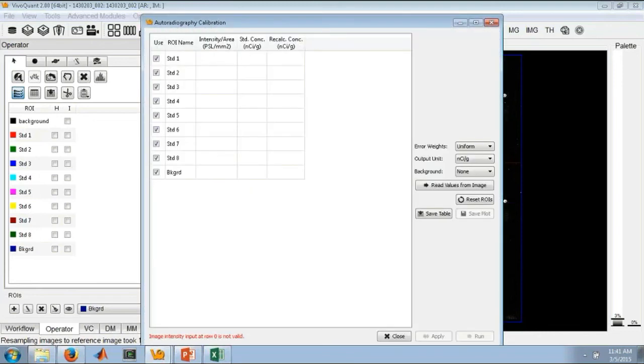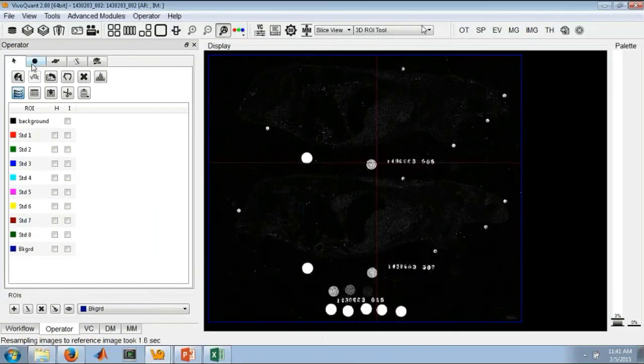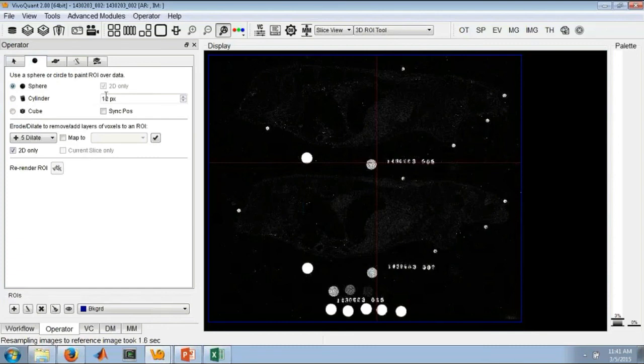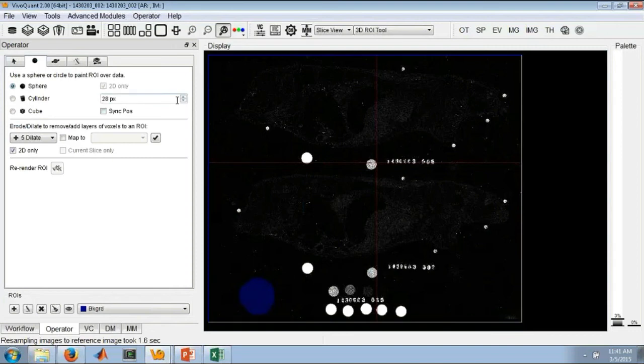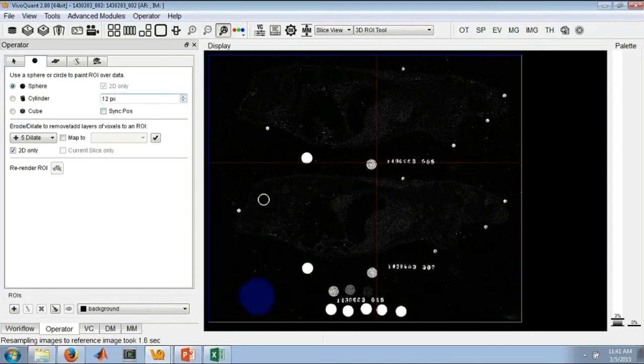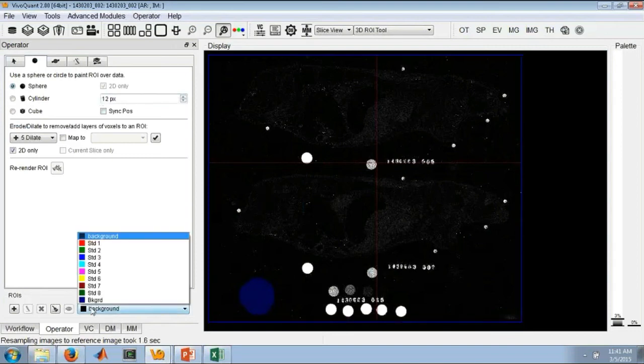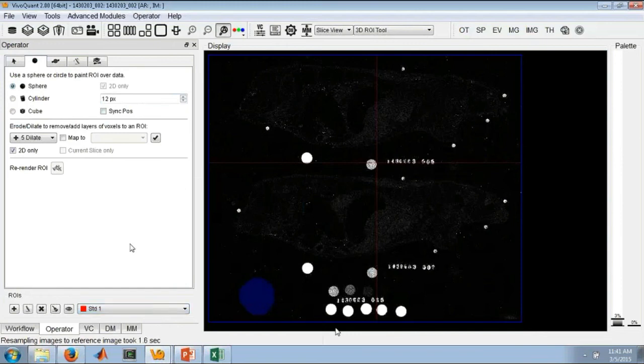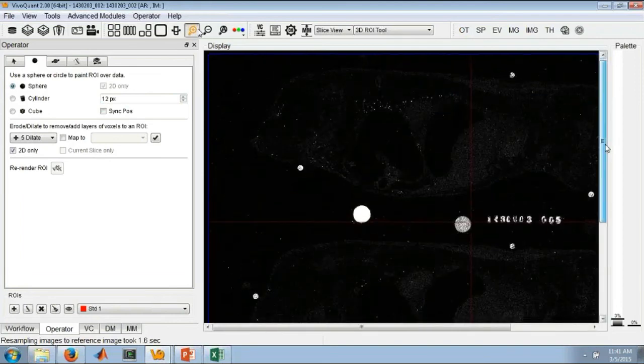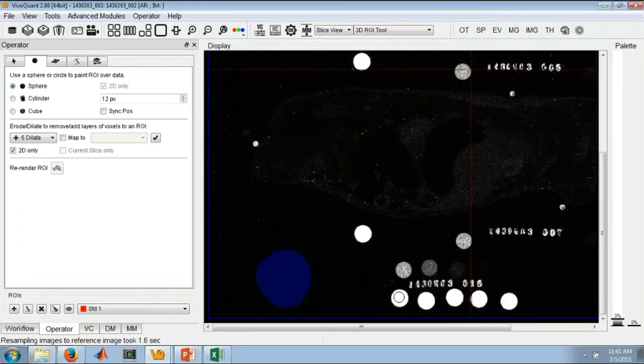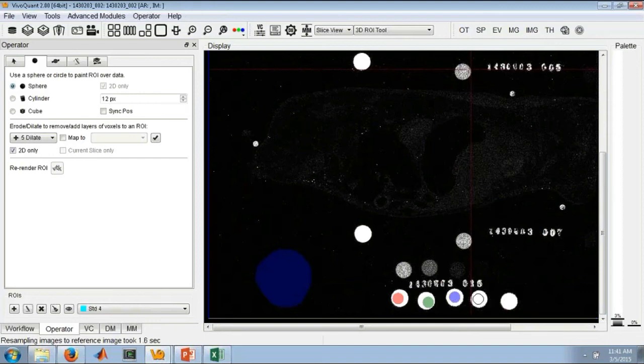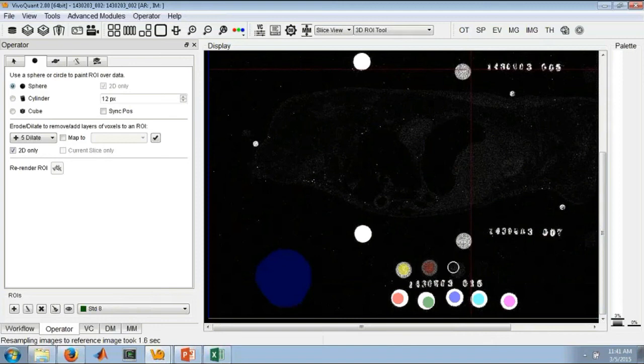Say okay. And then I can just quickly go through, draw a quick background, and then each of the standards in turn. Let's zoom in a little bit. Standard 1, 2, 3, 4. Now I have all my standards.